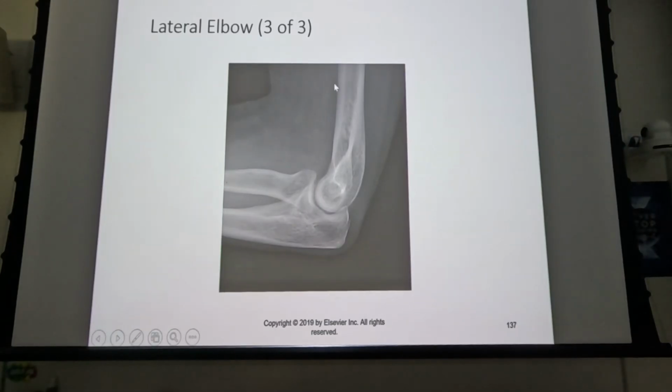So if the anterior fat pad bows out, it takes on a distinct appearance. It's closer to the bone at the top, and it bows out kind of like a sail on a 1700s pirate ship. We actually call that the sail sign. And that's an indication the patient may have a fracture of the distal humerus.